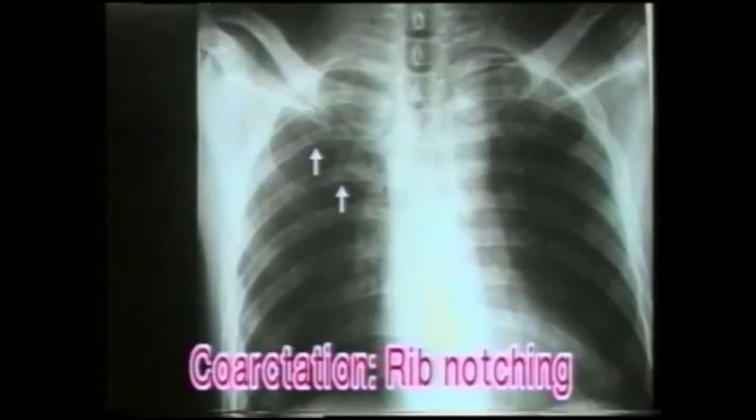In long-standing cases, the 3rd to 9th ribs show notching of the inferior border of the ribs in their posterolateral aspects. Note in close-up view the notching of the inferior border of the ribs in this case of coarctation of aorta. This notching is due to the dilated posterior intercostal arteries.